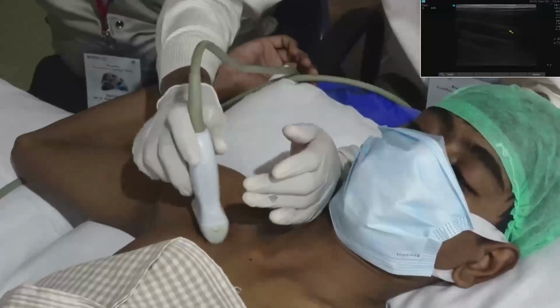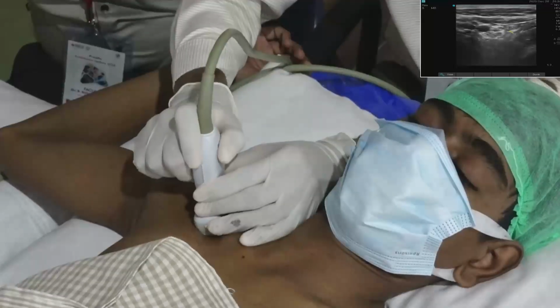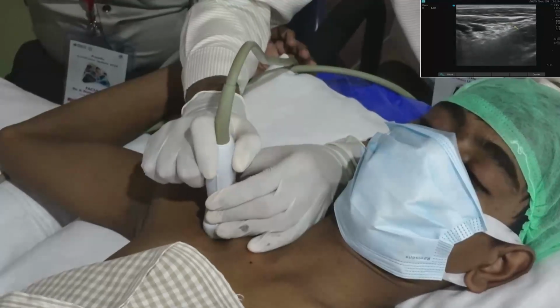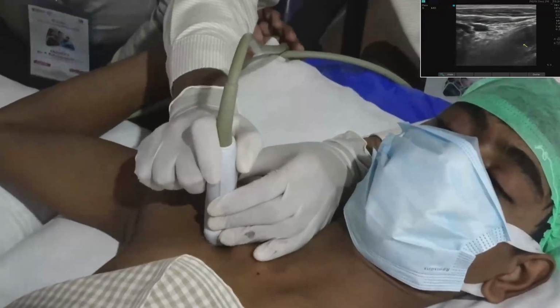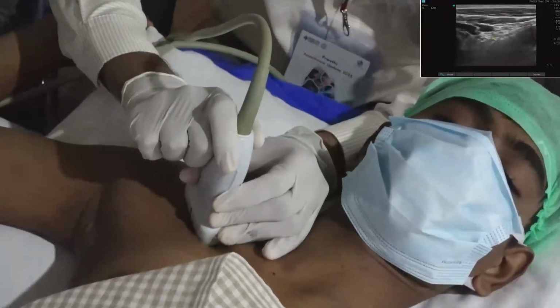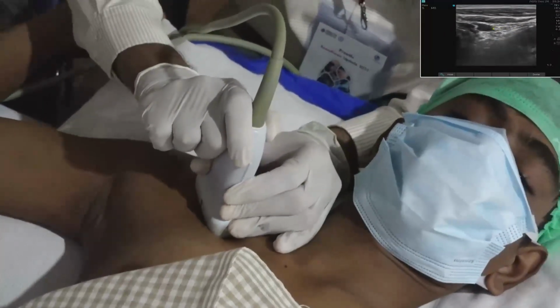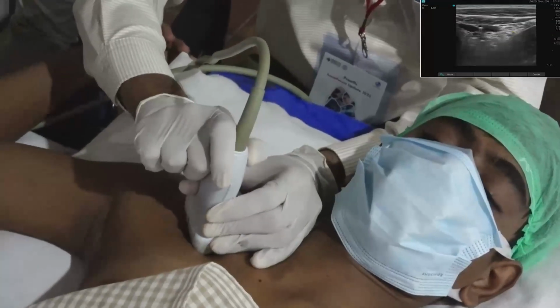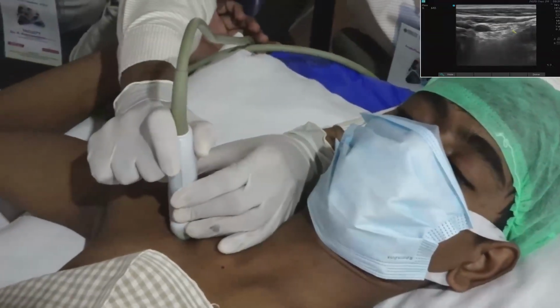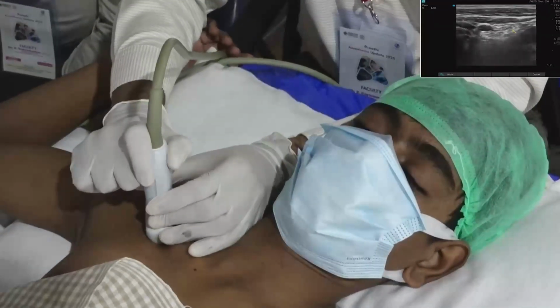So the idea is to see these three muscles, pectoralis major, subclavius, then serratus anterior. Then you can see the cords, which are very much clustered. Previously we were thinking of selective trunk block, but in recent updates they say the costoclavicular block is at the most clustered area of the cords, most clustered area of the brachial plexus. So this is called spinal anesthesia of the upper limb.